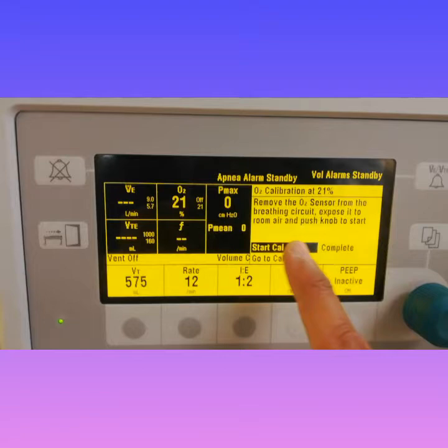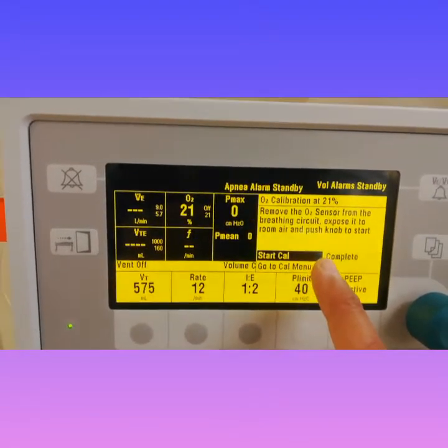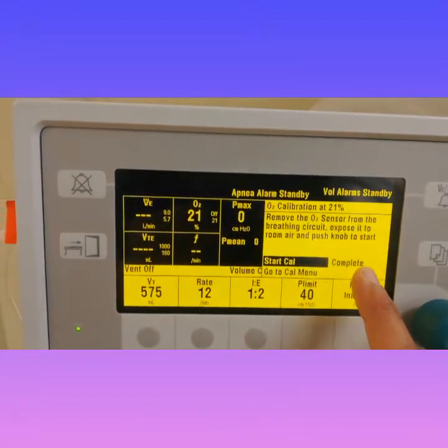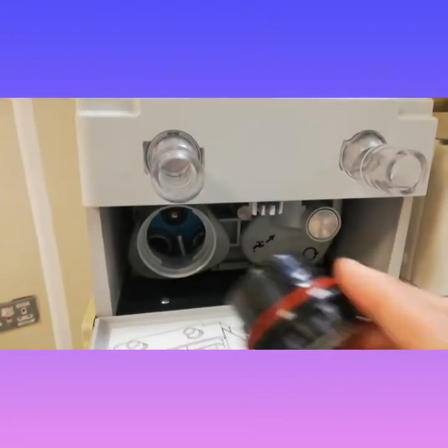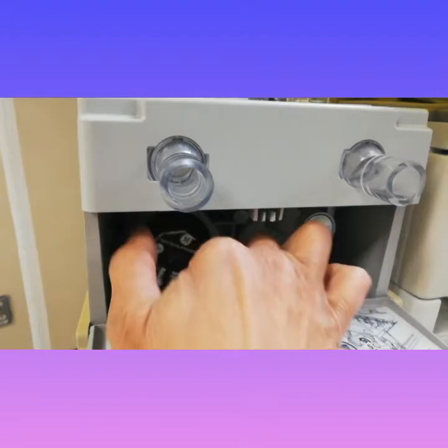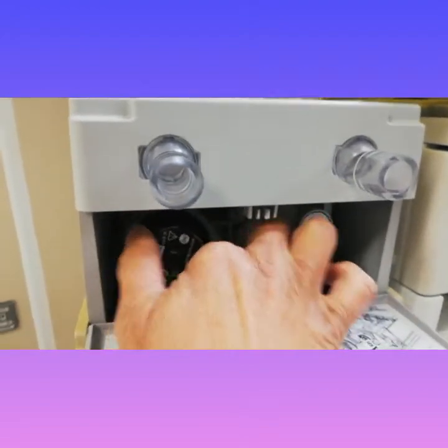Then it will tell you on the screen to reinstall the sensor, so put the oxygen sensor back and turn it clockwise.